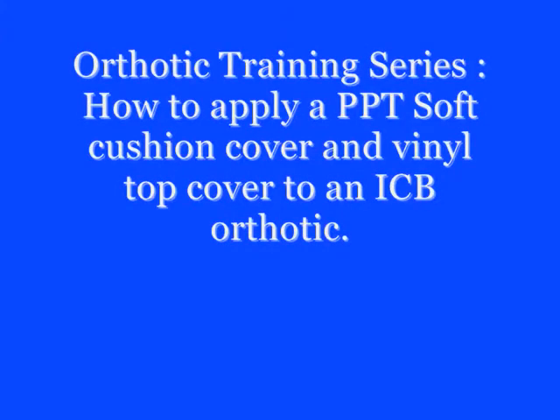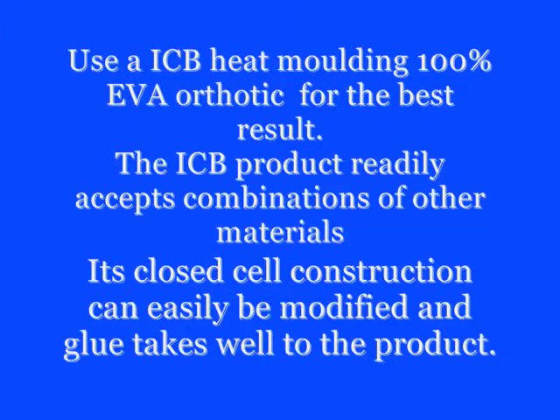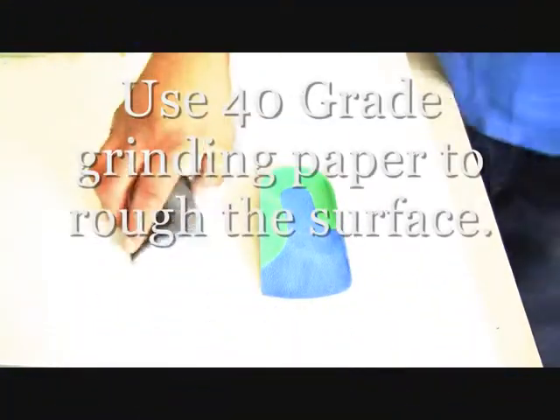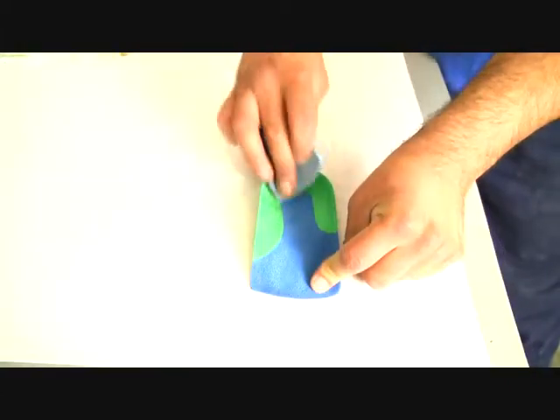How to apply a PPT soft cushion cover and a vinyl top cover to an ICB orthotic. The ICB product is 100% EVA and readily accepts different combinations of materials. Use a 40 grade grinding paper to rough the surface of the ICB orthotic.